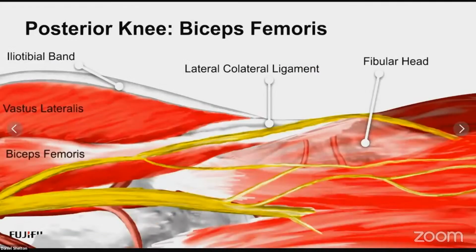semimembranosus. And then as another landmark and reference laterally, we're going to move over and scan the biceps femoris, see its relation to the vastus lateralis. And then after we cover the skeletal structures and the musculotendinous region, we'll get into the neurovascular structures.